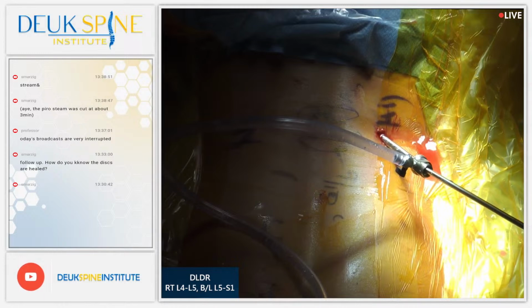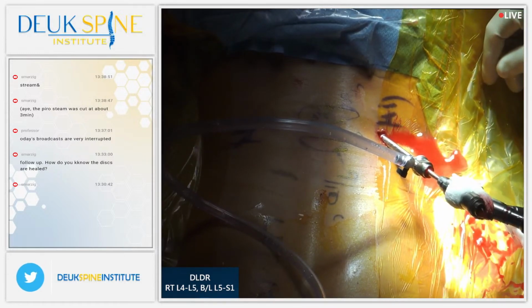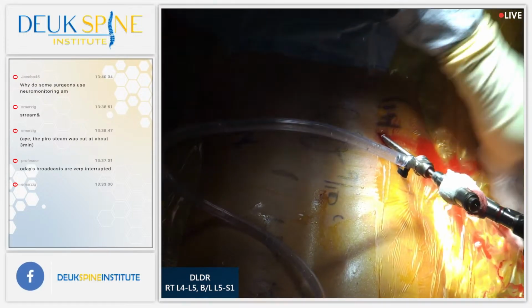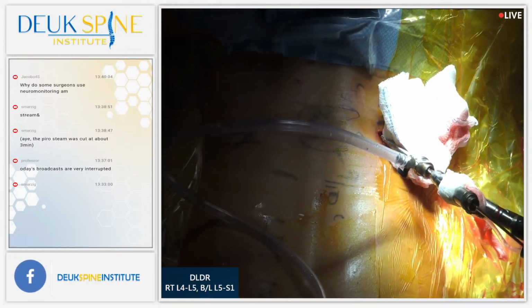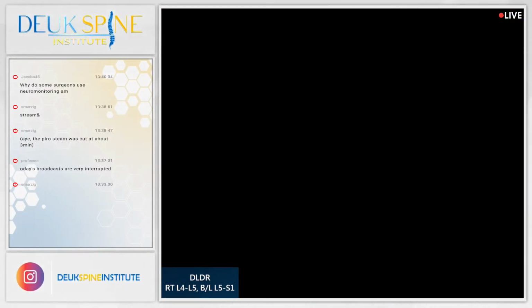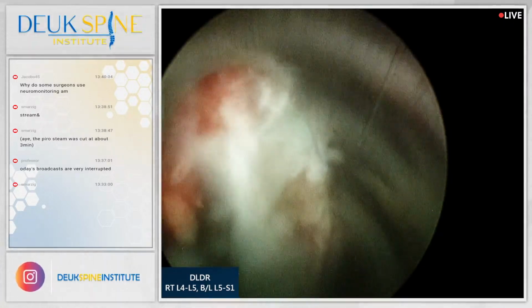It's like T10, 11? All right. That's what I mean by the blood. Very common since we're seeing the blood from the other side. Is the scope on? All right, we're inside the disc and hopefully not have too much to do on this side.